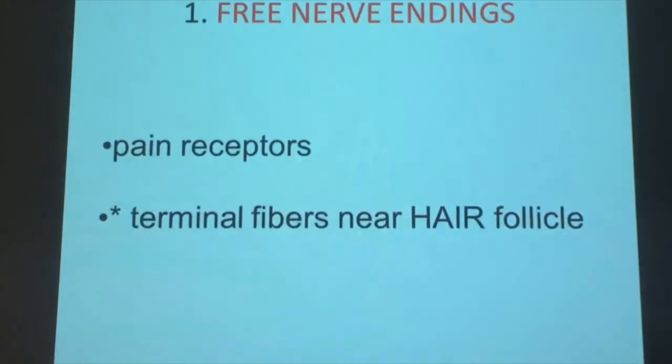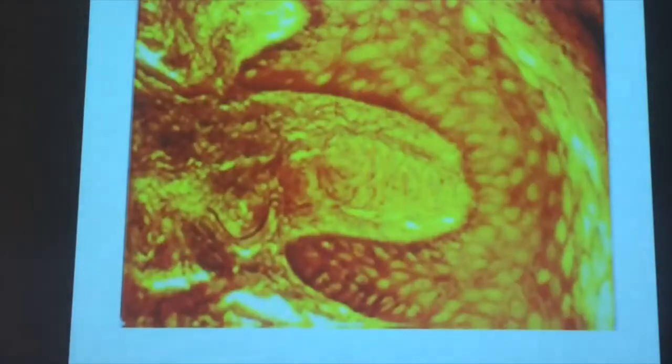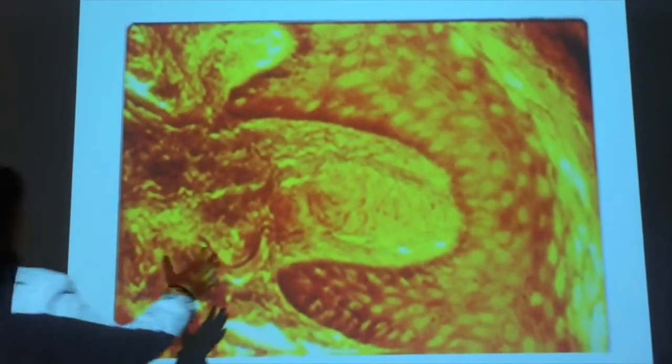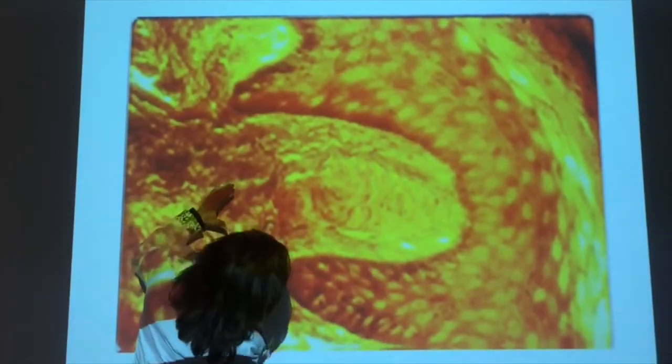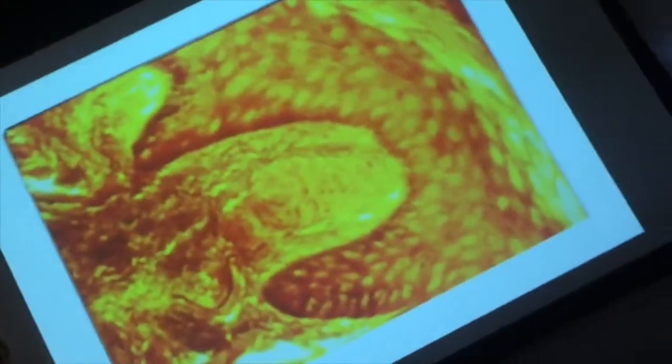Go ahead and forward to the right. Go ahead. That's it right there. So if you turn your head this way, just turn the video for a second, just so they can see it. Yeah, and then go back.